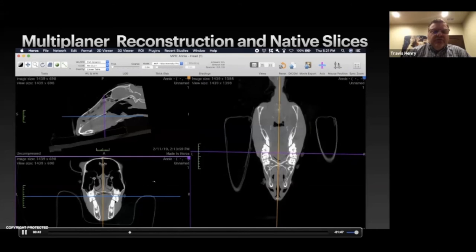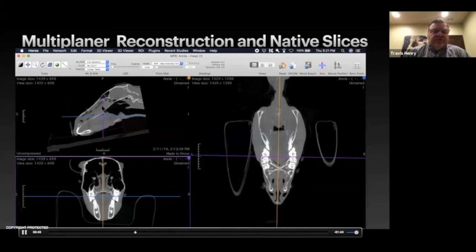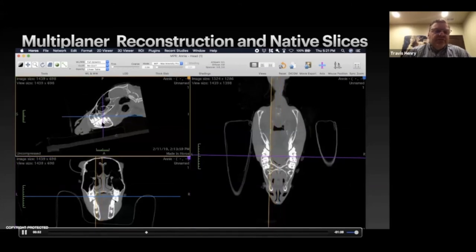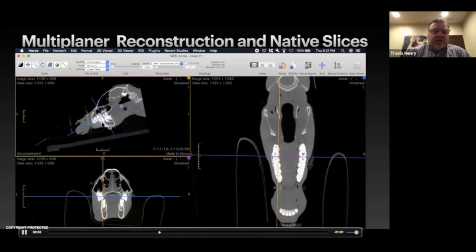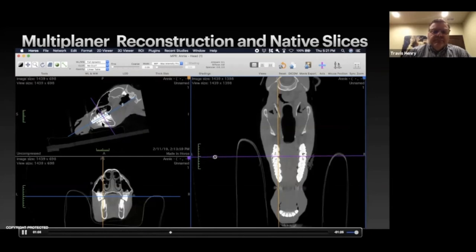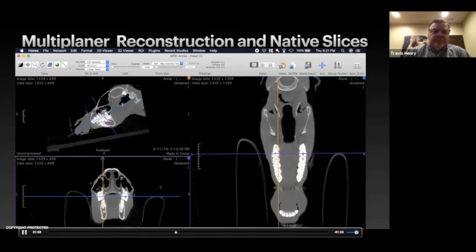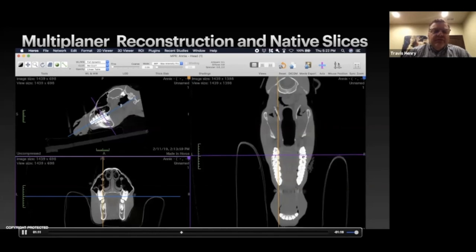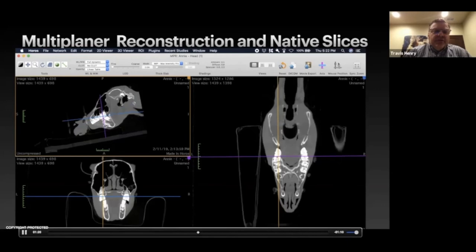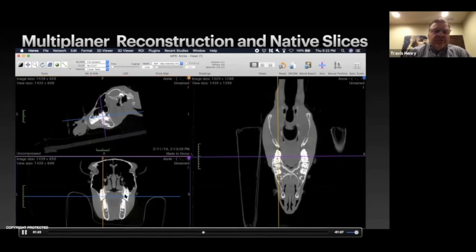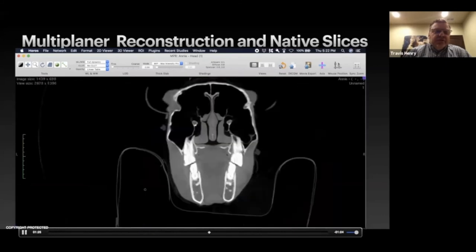There's good reason sometimes to reposition the line to follow a specific tooth. For example, tooth number 11 angles distally, and we'll often want to be right on that tooth. Here we look at tooth 9 — you can see it coming into view nicely. Going farther back to tooth 11, we can see part of tooth 10 and part of 11, so I angle back and scroll through the slices to get both 11s individually so I can compare right and left.